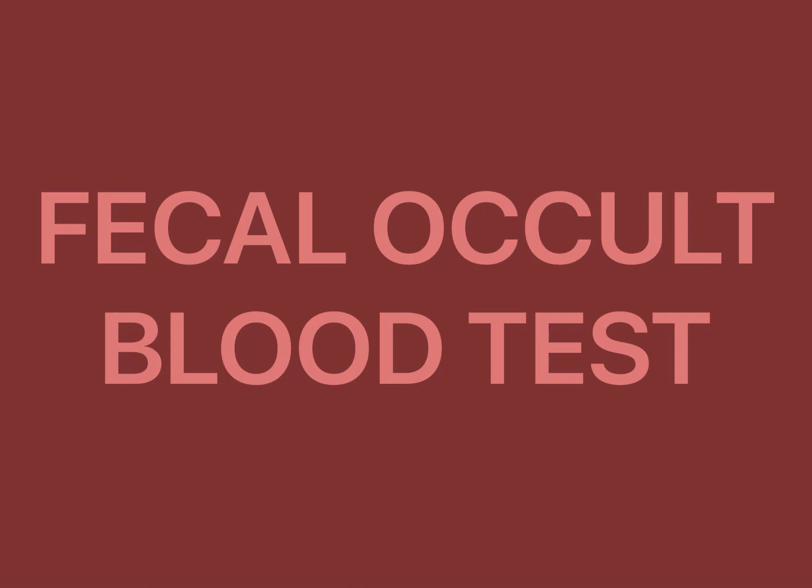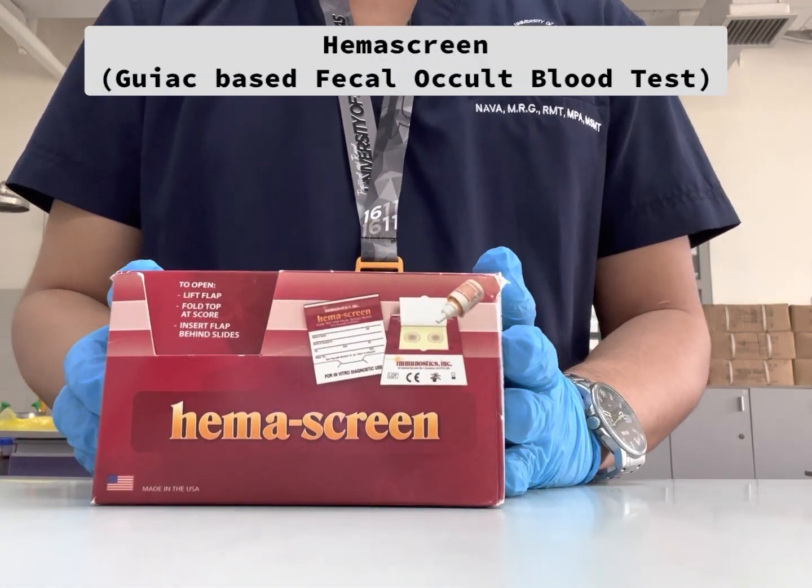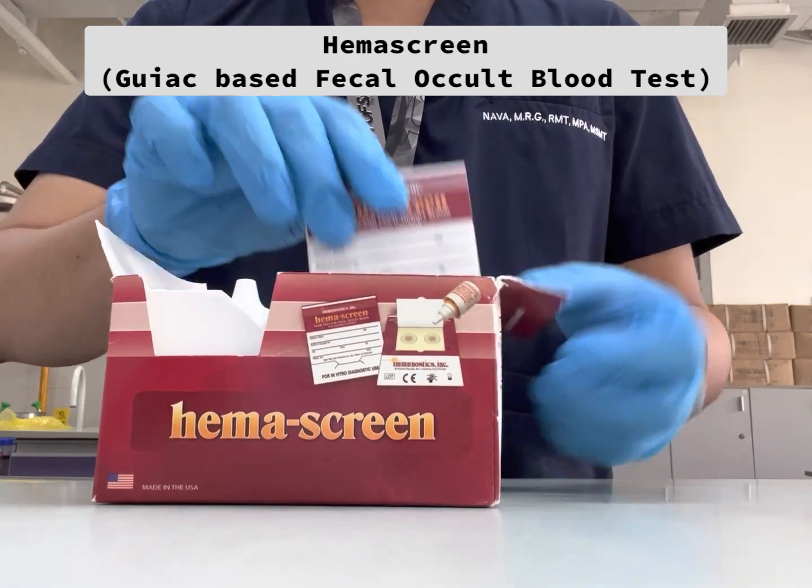Hello everyone! For today's video, we're going to watch the procedure for fecal occult blood test. The reagent that we're going to use is HemaScreen, which is a guaiac-based fecal occult blood test.